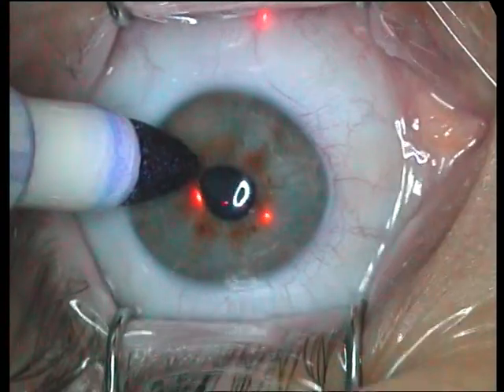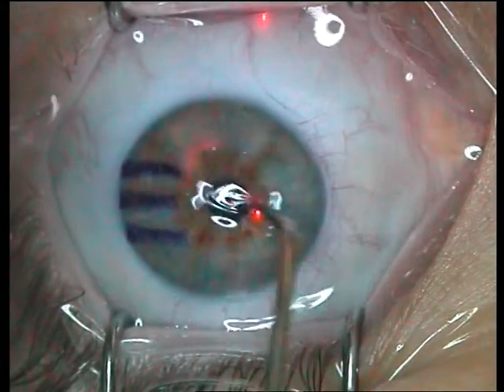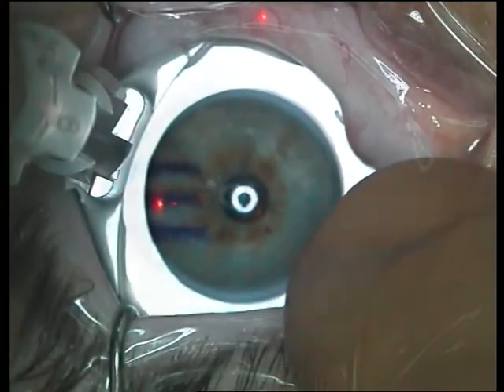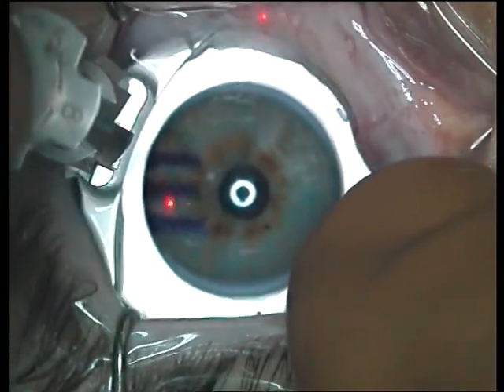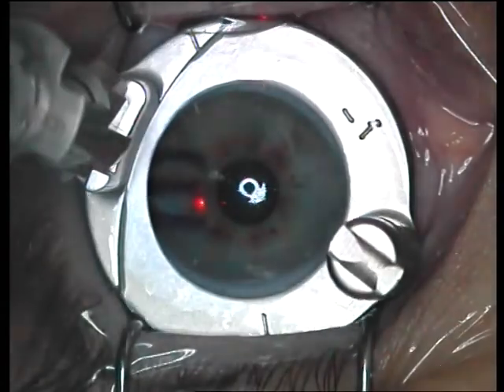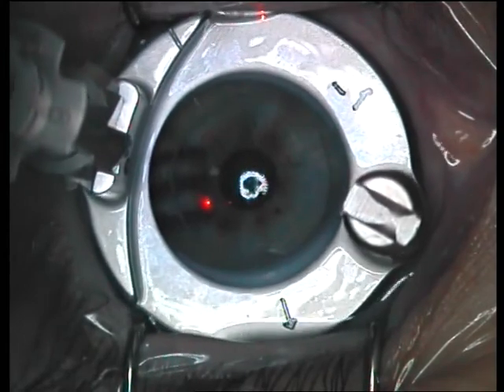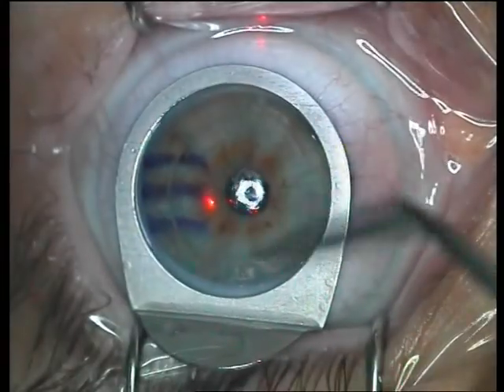Wash under the flap and the procedure is through. In our final case, we can see again the corneal markings. Wash off any extra ink. Suction ring placed on the eye, suction started, applanation done to confirm the suction is correct, the cornea is wet. The microkeratome head is placed on the ring, locked into position, advanced until it reaches its stop, reversed, unlocked, and removed. Suction stopped, ring removed.